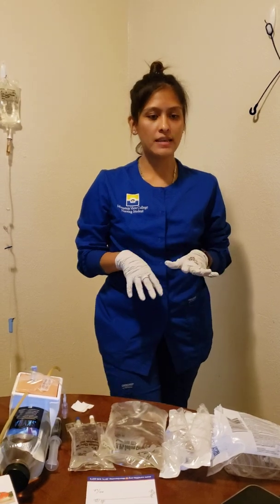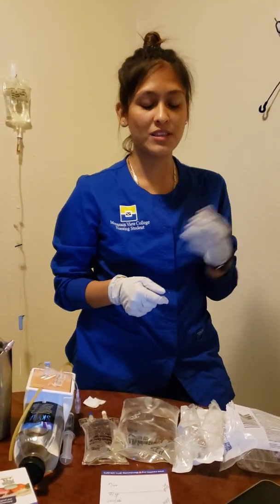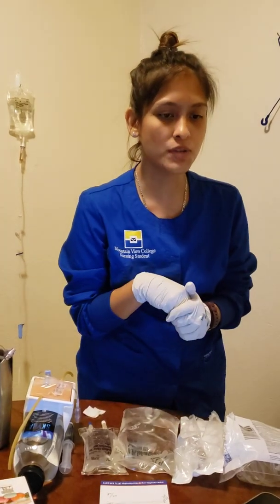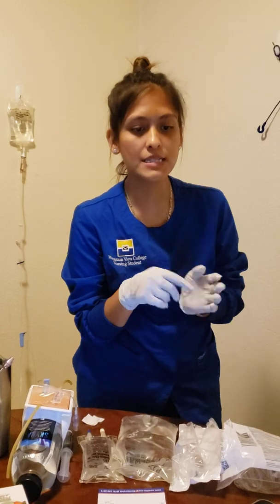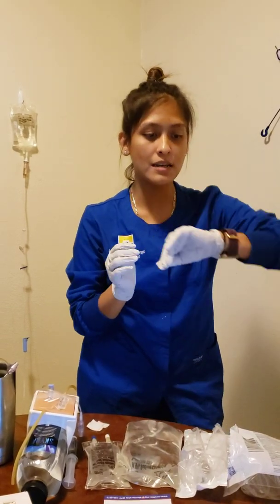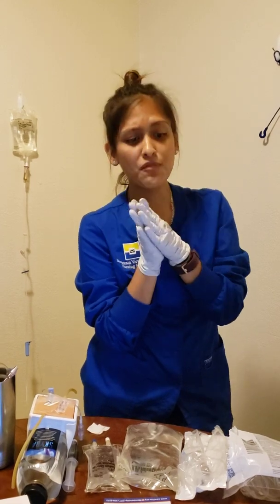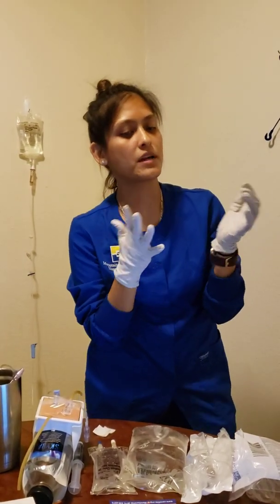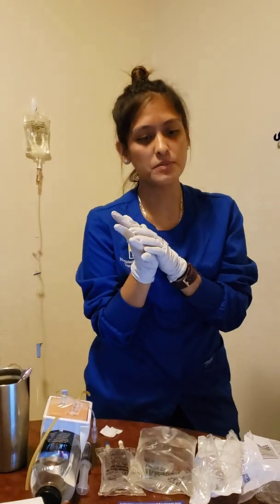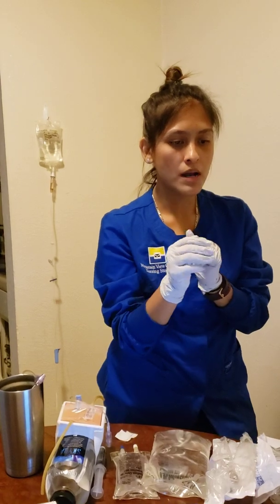So the first thing that I want to do is make sure that I verify my patient's MAR with the physician order. So I'm going to go ahead and do that. This is for Miss Wanda Chi, 9/20/19XX. It's 8 o'clock. And I'm going to be giving 500 ml of 0.9% sodium chloride to infuse over 10 hours, drop factor micro drip tubing, 60 drops per milliliter. That matches my physician's order and my MAR.